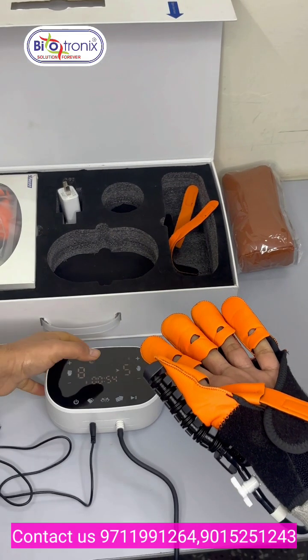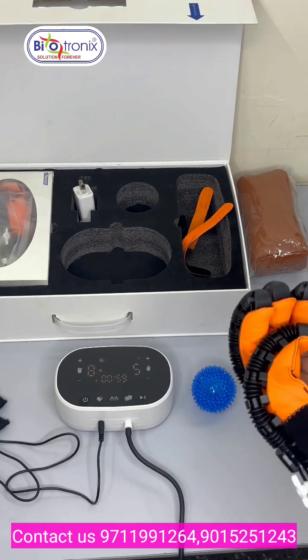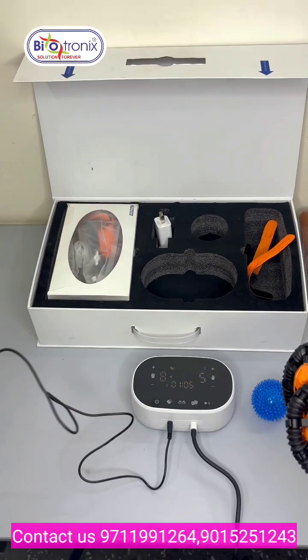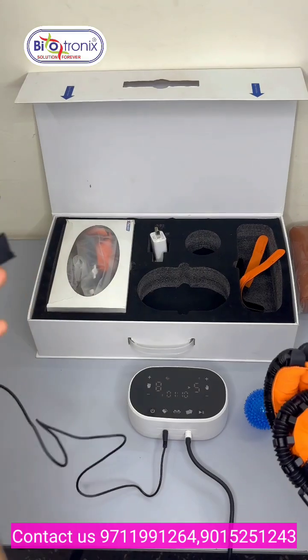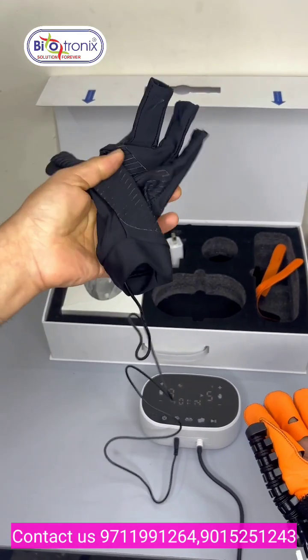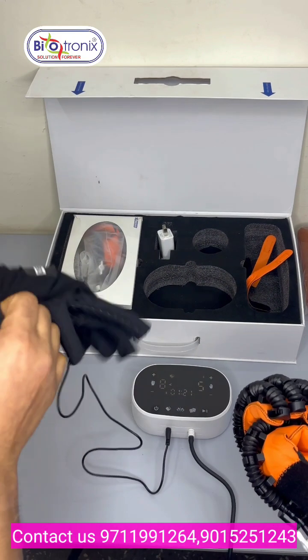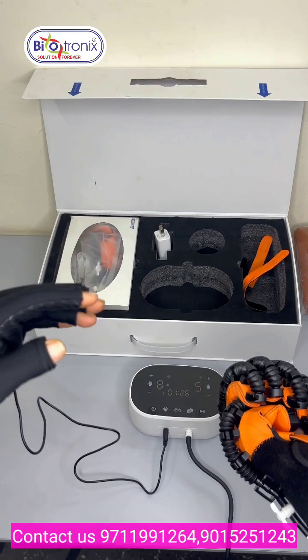So now I'm telling you about the second training mode, which is mirror training mode. In the mirror training mode, there is a data glove. The activity you perform in the data glove will happen in the rehabilitation glove. That is why it is called mirror training. The action you perform here will be mirrored to the rehabilitation glove. The doctor or the patient can wear the data glove.